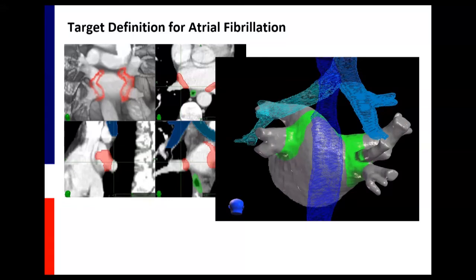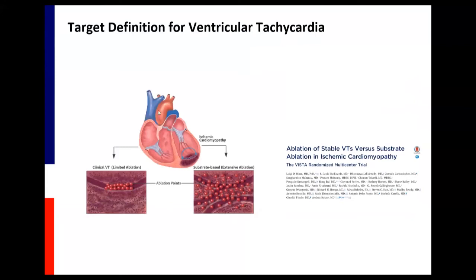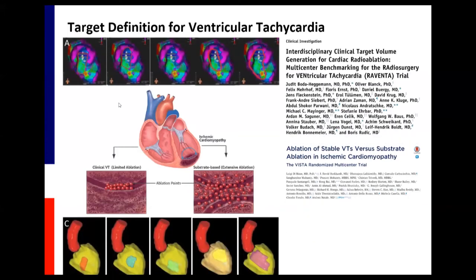But it has turned out that, you know, for VT, it's a much better use, and the patients will benefit much better from that. So let's have a look at target definition for VT, and Judith has presented that already. There are different ideas on locating the clinical VT or treating basically the whole substrate. And there was some question in the chat, you know, of treating the border zones and such. So that's very unknown. And if you present that idea, or an electrophysiology map, to 5 different cardiologists, they will treat 5 different things, which is really interesting to see. And it makes it really hard to reproduce.